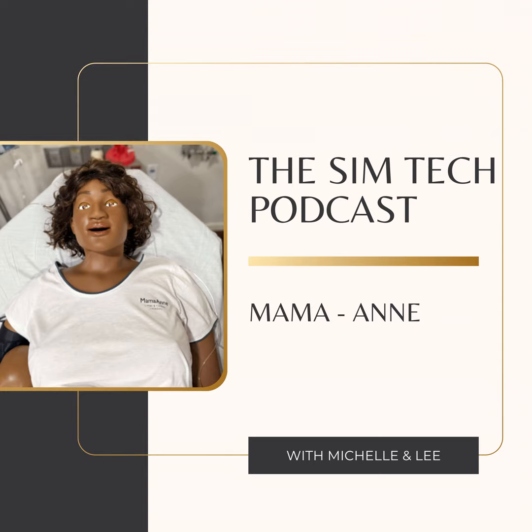So for those of you that are driving in your cars listening to this podcast and you can't actually see the live video, hopefully you'll be able to watch it a bit later on, but I'll try and explain everything as best as I can throughout. So it says manual or automatic mode, so we're going to select manual mode even though we still set the simulator up in a pretty automated way, which is really nice and makes our life a lot easier when we're trying to prepare for simulation, control the simulator and do all the other stuff that we do when we're running around trying to prepare for simulation. So we're going to select manual mode.